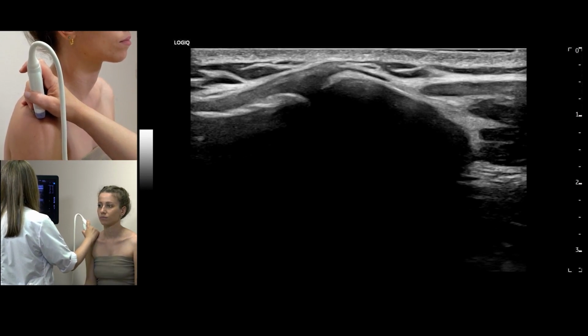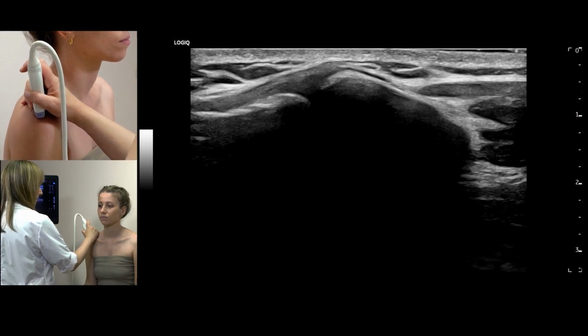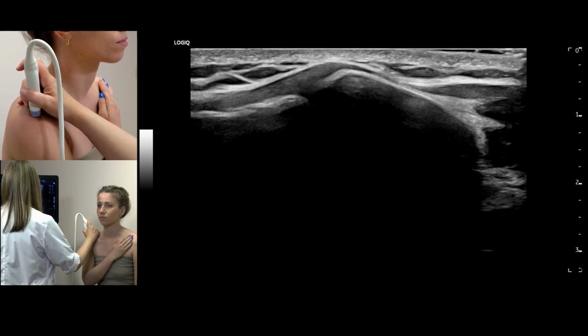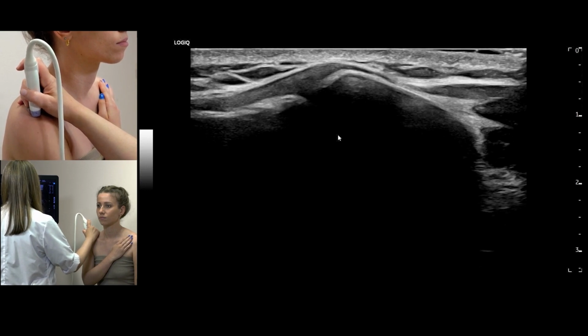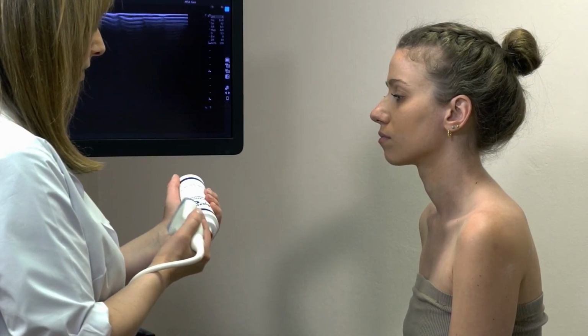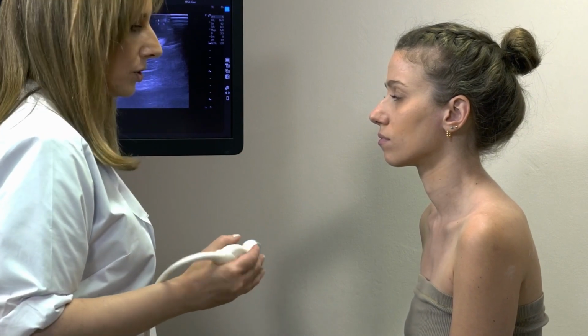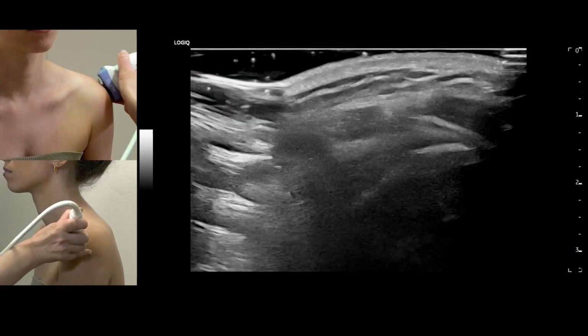And this is called the cross-arm maneuver. We can see that in normal situations, the two bones don't move away significantly the one from the other. Now we are going to study the subacromial space and perform the dynamic maneuver we use for studying impingement.